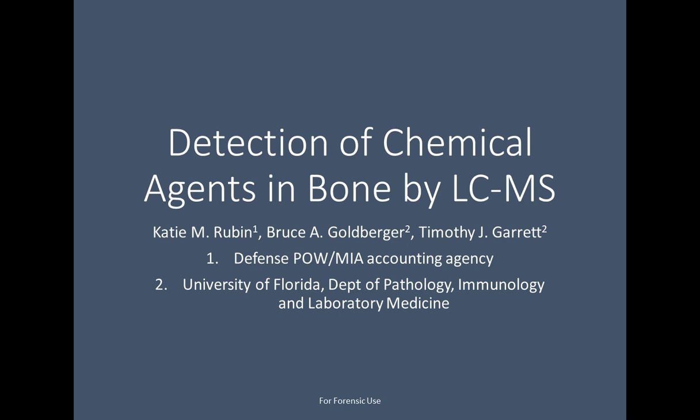So we had to optimize how you pulverize the bone, and different kinds of bone will have different strengths, so that kind of pulverization might vary depending on the type of bone you're analyzing. And then we also had to verify all across the approach that the extraction from that kind of pulverized material would be a valid approach for doing extractions.